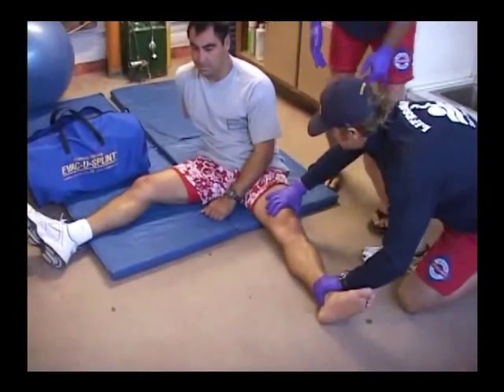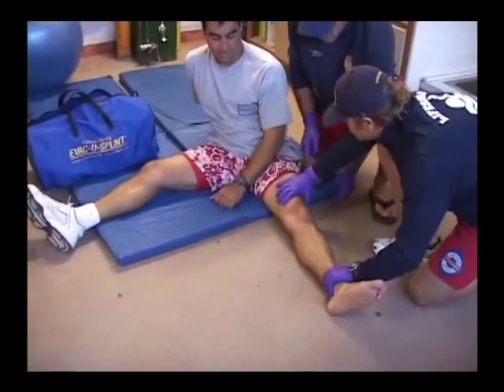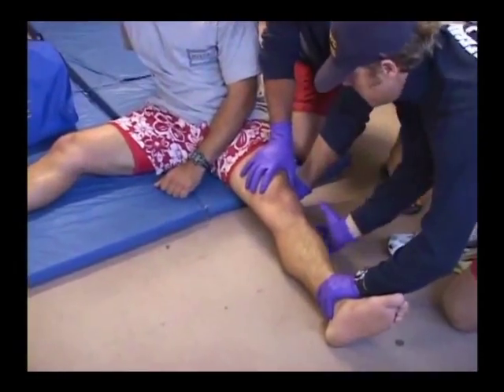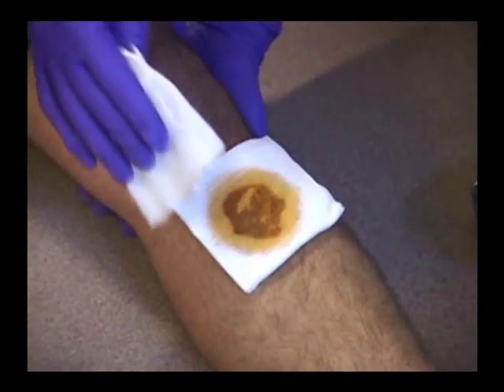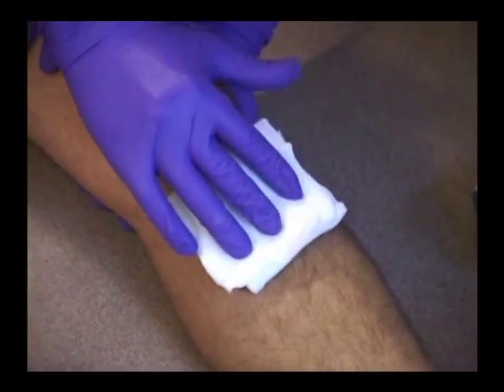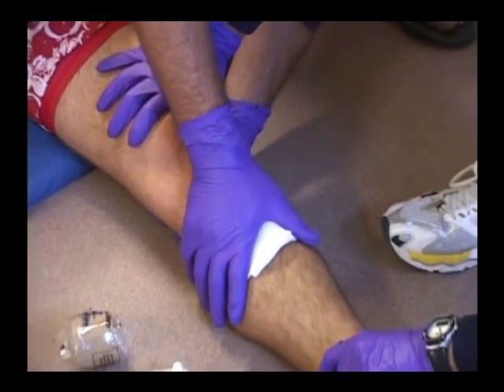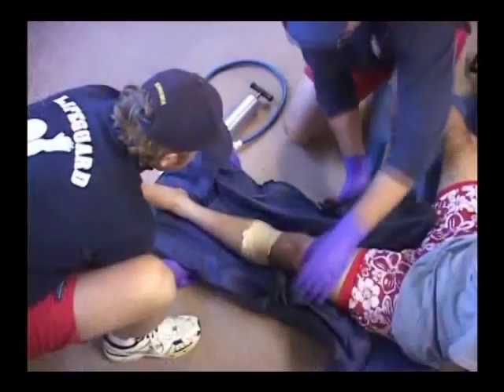Maintain manual support of the injured area while coordinating additional assistance during the evacu-splint immobilization process. Your healthcare partner or a qualified assistant should apply appropriate dressings to all wounds in and around the suspected fracture site.